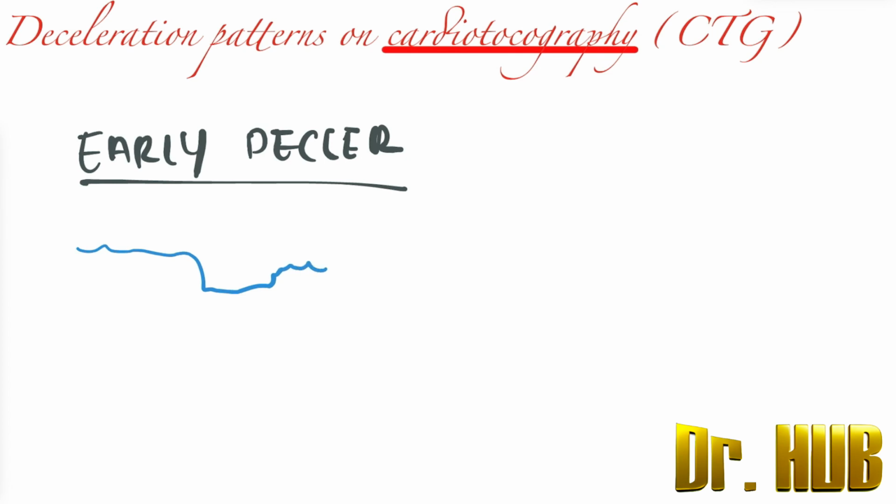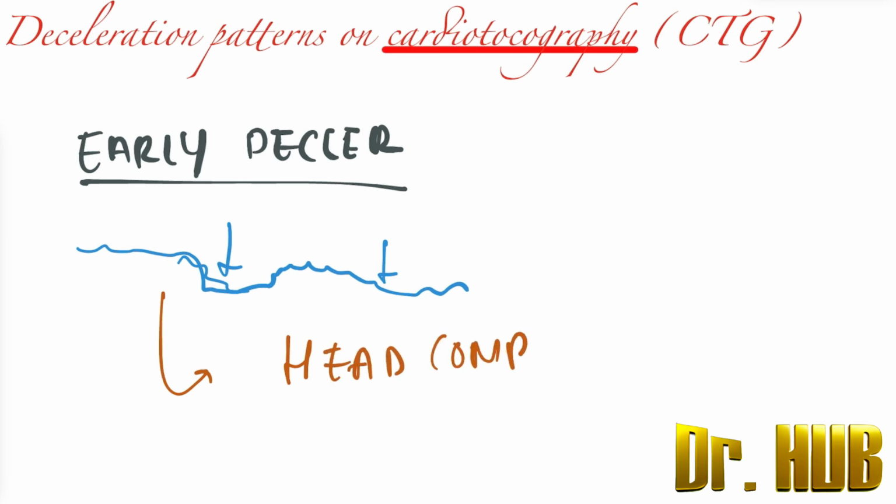So in terms of the early deceleration, what we are seeing is it is seen in terms of the head compression. So in terms of the head compression, this early deceleration will be seen.